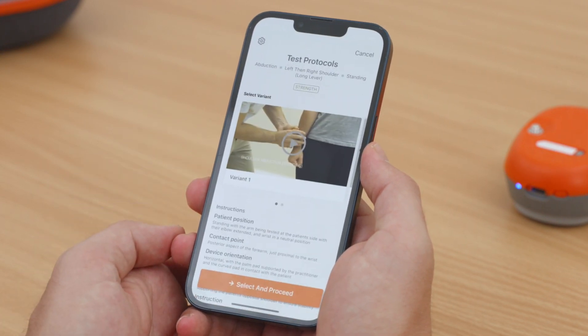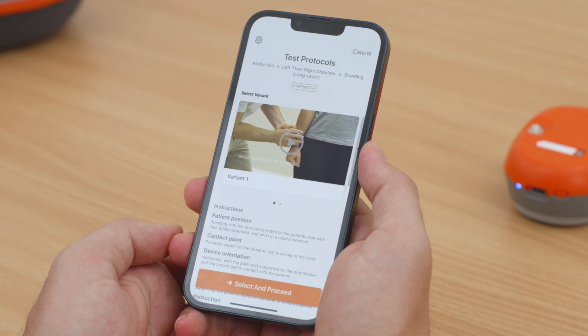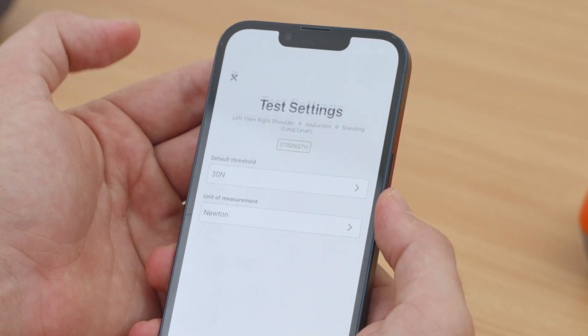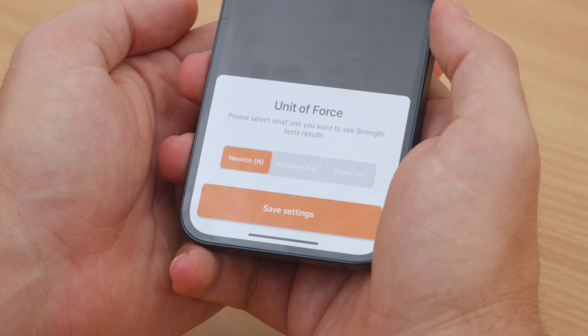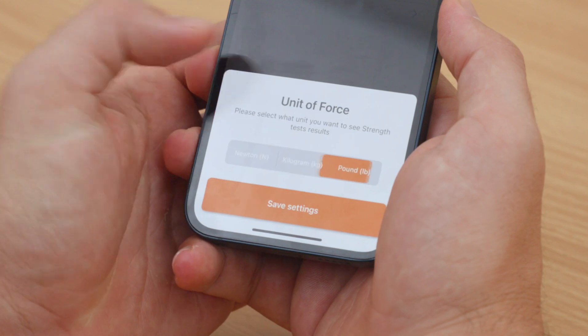The app presents a protocol video and written instructions so that you can reliably and accurately perform a strength or range of motion assessment. You can easily adjust the units of measurement before starting your test by clicking the Settings cog in the top left. The Dynamo Lite can measure force in Newtons, Kilograms, or Pounds.